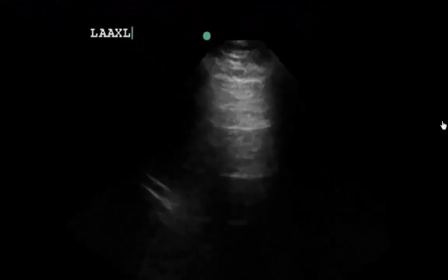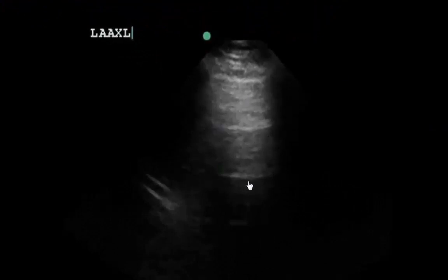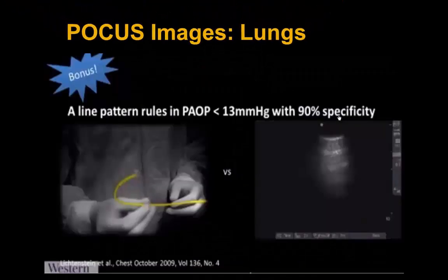In the lung fields, the left anterior axillary line shows primarily an A-line pattern with reverberation artifact down from the pleural line. The patient also had this bilaterally, indicating A-lines and dry lungs, with no consolidations or pleural effusions noted. Based on Lichtenstein et al's work, an A-line pattern has a 90% specificity for low left atrial pressures — less than 13 mmHg — as compared to a Swan-Ganz catheter PA capillary wedge pressure, indicating no CHF at this time.